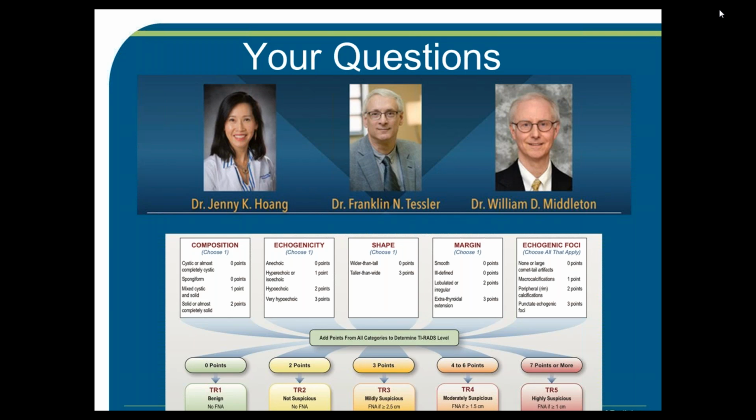How would you report it? Now, I'm sorry, say that again, Jenny? How would you TI-RADS 6? Well, how would you report a thyroid nodule that is known to be malignant, that you're actively surveilling?